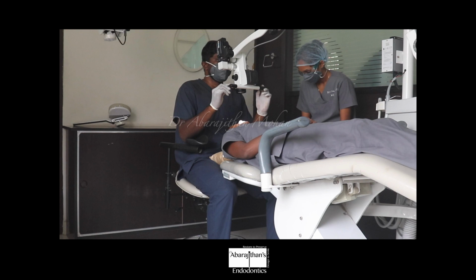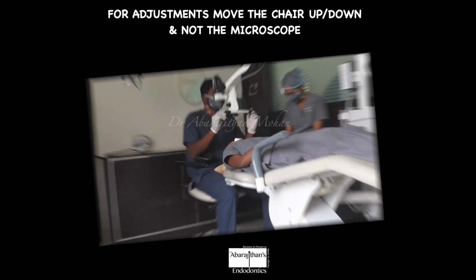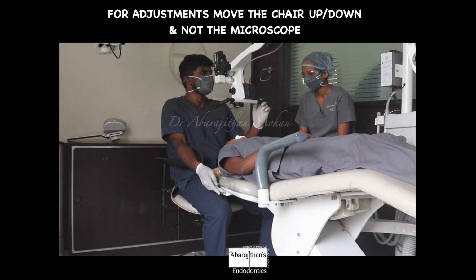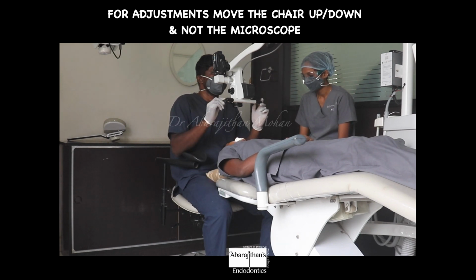It should never be the other way around. We should not move the microscope up or down to focus, and we need not adjust the operator's stool also to keep the microscope on focus. So after this, it's always the patient's chair that needs to be moved up or down for fine focusing. So this way, the operator is always in a very comfortable position throughout the procedure.